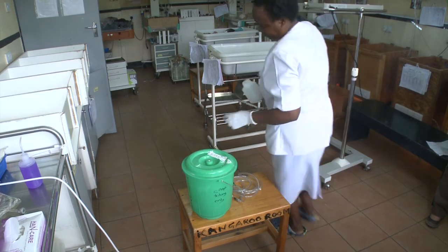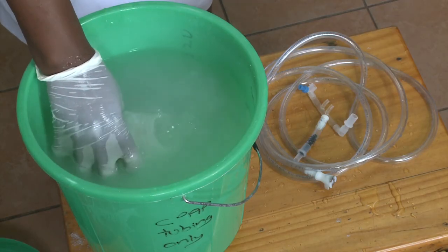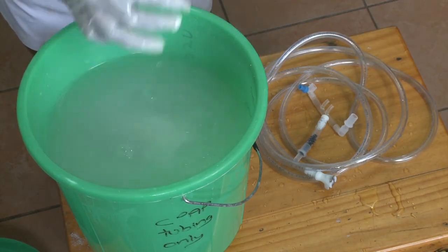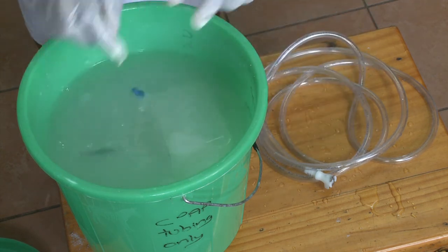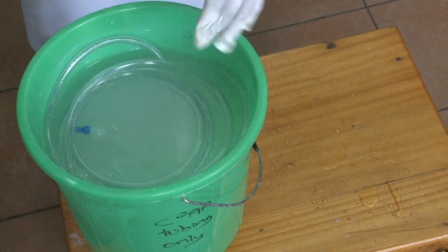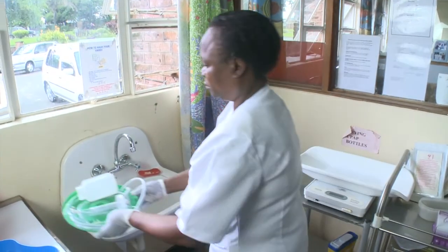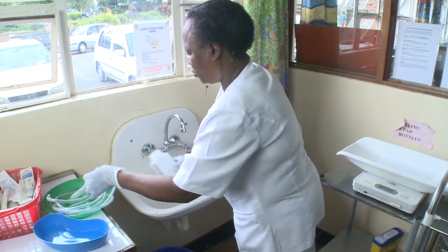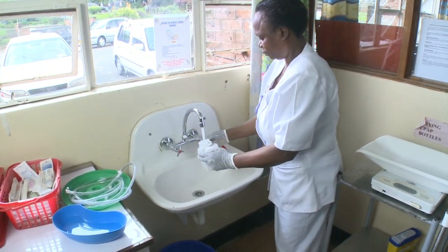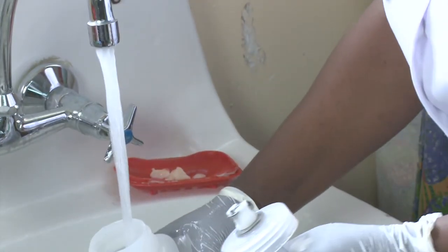The tubes and the bottle all need to be soaked in chlorine 0.5. Make sure to immerse the bottle so it doesn't just float on the surface. The tubes need to be soaked for 10 minutes in the chlorine solution.